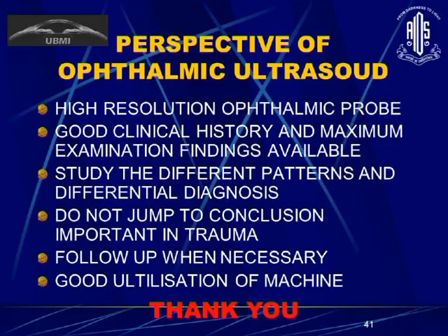So in perspective, a high resolution ophthalmic probe is very useful. Probably not in all clinical situations, but in some it helps us to highlight certain areas better. If you have a good clinical history and maximum examination findings, it helps us to differentiate a lot of membranes and echoes in the vitreous cavity, and helps us to differentiate different patterns. Do not jump to conclusions, especially in trauma. That's the message I want to give. Do not make bold diagnoses on day one of trauma. The whole picture changes in 10-15 days, and always do an ultrasound prior to doing a final vitrectomy surgery. And follow-up sometimes helps us to give a clearer picture.